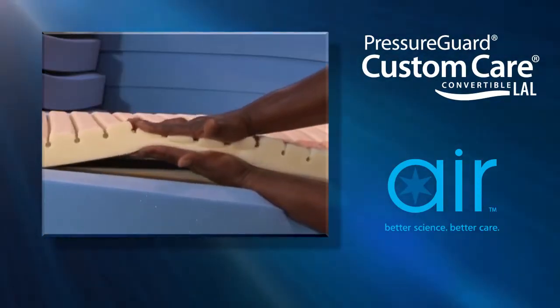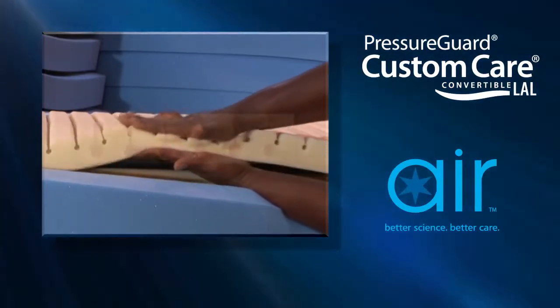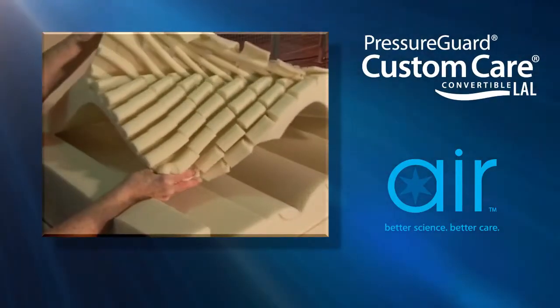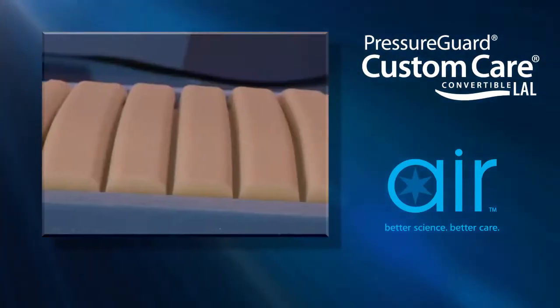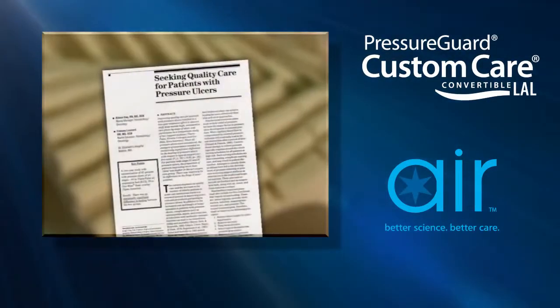The GeoMat top layer, with more than 800 pressure redistributing support cells and an exclusive ring of air, is cut with SPAN's unique GeoMat segmentation, which reduces heat and moisture buildup on the skin and has been clinically proven to reduce pressure.